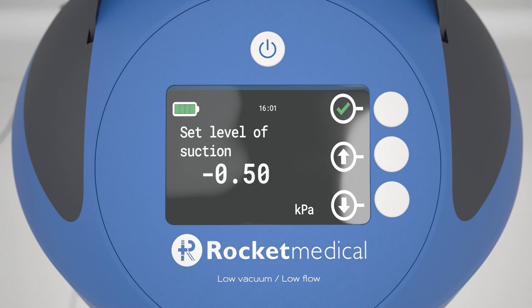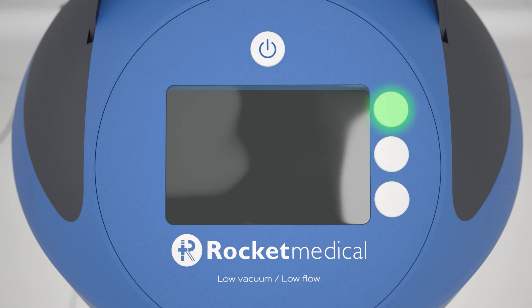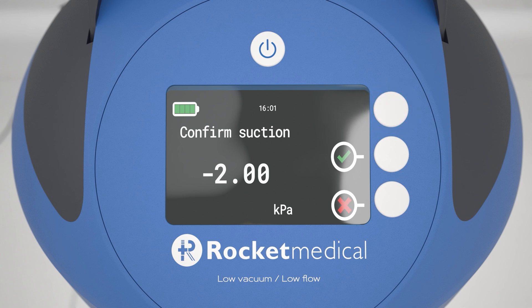Set the amount of suction required. Press the increase or decrease buttons until you are at the level you require. The level of suction applied increases in minus 0.5 kilopascals, minus 5 centimeters of water or 3.75 millimeters of mercury increments. Alternatively, you may select the gravity drainage option. Confirm your decision by pressing and holding the highlighted button for more than two seconds. The PSU will then apply suction to the chest drain unit and the patient.